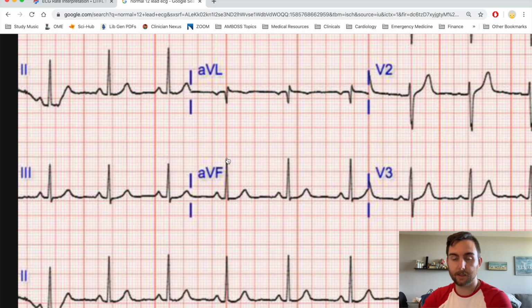So this is going to make sense in a second, I promise. It's not hard. We just count 300, 150, 100, 75, 60. Doing it again, starting here: 300, 150, 100, 75, 60.